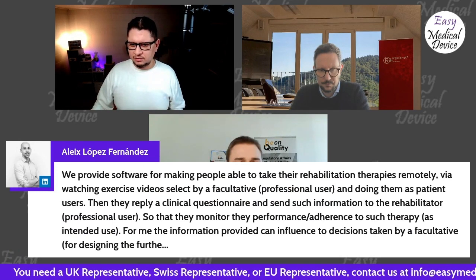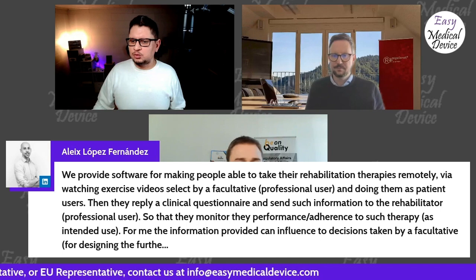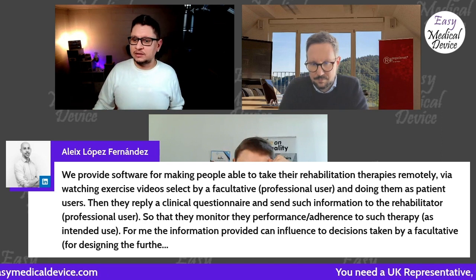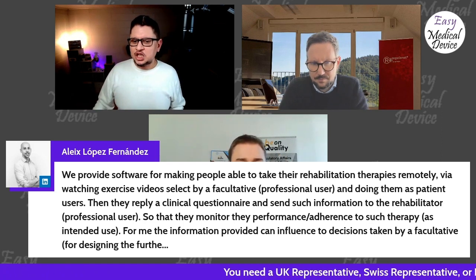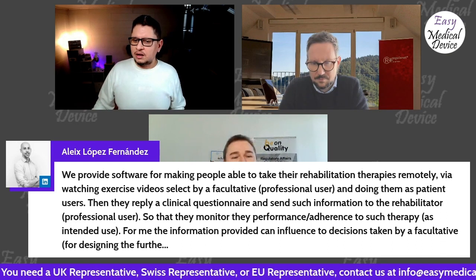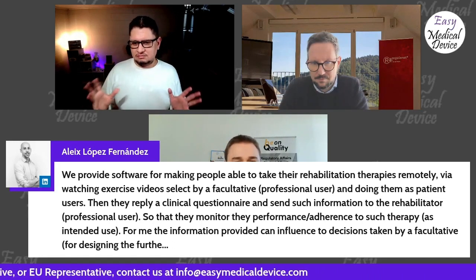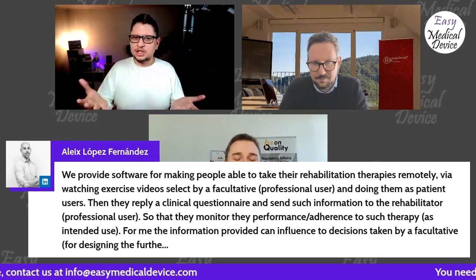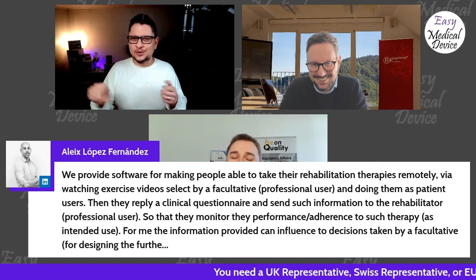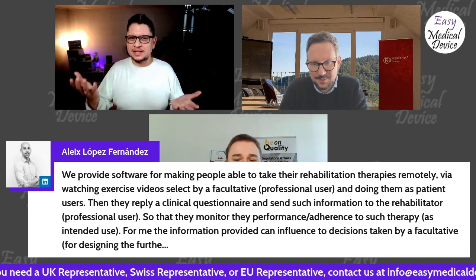Okay, so here we have another example, and maybe it can be related to a bit of what you said, but not everything. Alex Lopez Fernandez says that we provide software for making people able to take their rehabilitation therapy remotely, by watching exercise videos selected by a healthcare professional user and doing them as patient users. Then they reply to a questionnaire to send the information to the rehabilitator, so they monitor their performance, etc. So this kind of device, what do you think? It's like I'm watching some YouTube videos, doing the exercises, and after my exercise, I answer some questions to say I feel less pain, or something like that. And then I send that to my therapist.